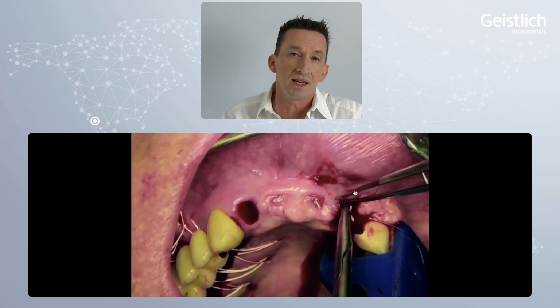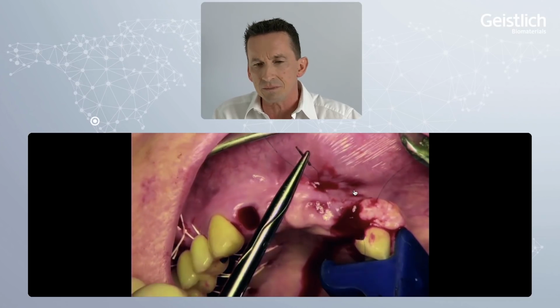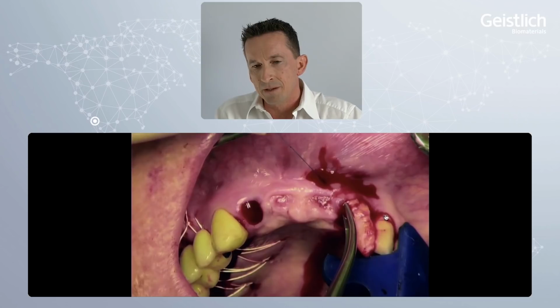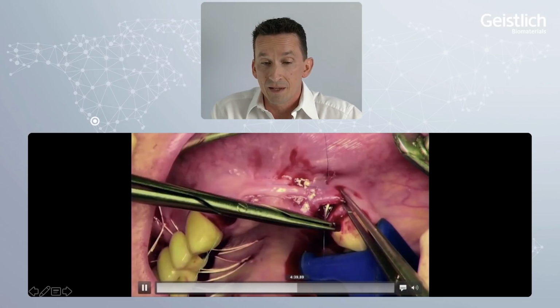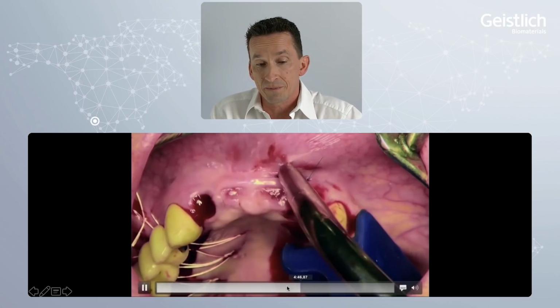You just pull it in with a positioning suture. Very easy to suture in. Here you see you can pull without any rupture, of course. And with a microsuturing technique, we only fix the margins.